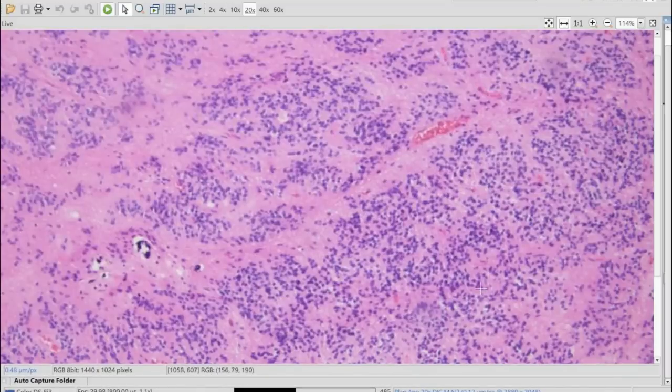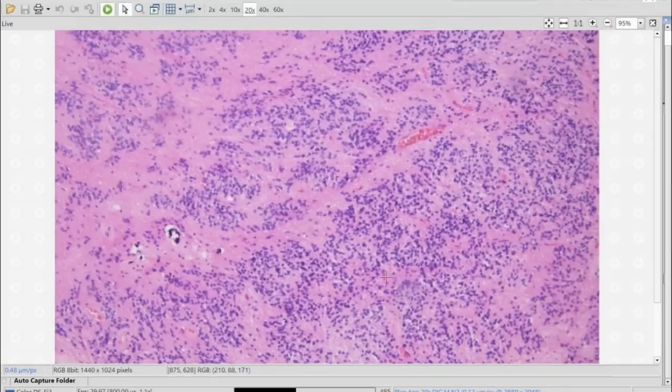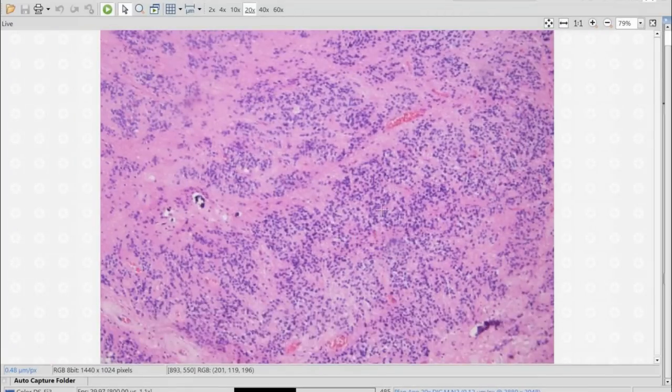This has very little proliferation. But you do have an unquestionable ependymal component in addition to the subependymoma. So it's something just to have in mind. And again, the criteria are not well established, but my feeling is that this being so low grade, architecturally has a lot of the features of subependymoma that probably will behave in a similar fashion. But you really have to highlight the presence of a more conventional ependymal component.